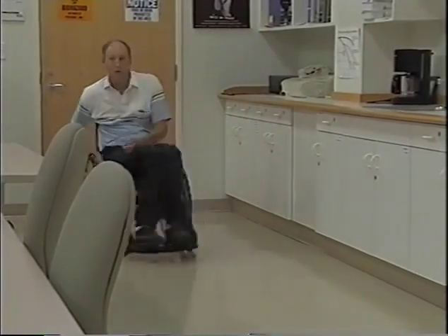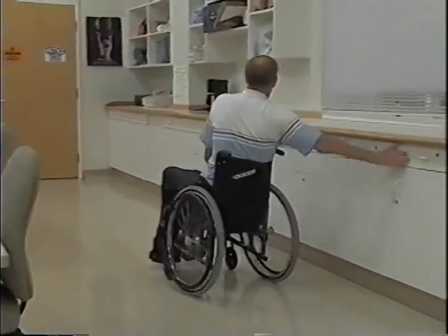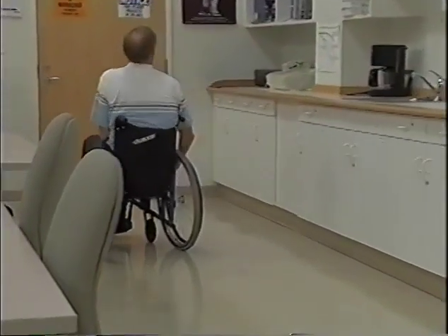Basically, when you learn to wheel, you can wheel all over the place with just one arm. So you should be able to travel anywhere you need to go with one arm, just pushing yourself along and turning around. So it's something you use mostly in the house when you're carrying a hot plate of food or a hot drink or something like that. It's just a good little skill to learn.